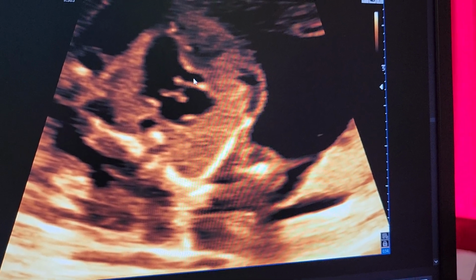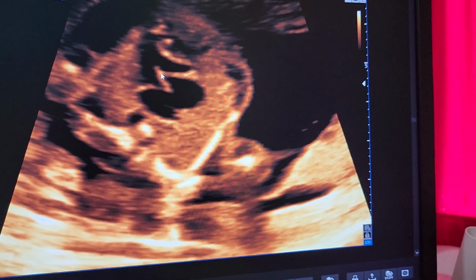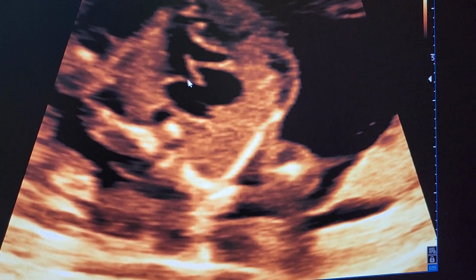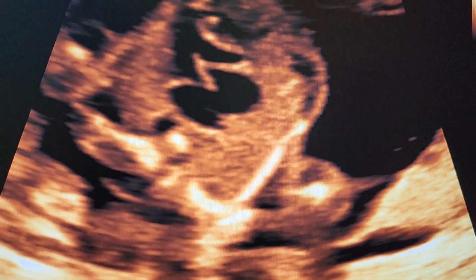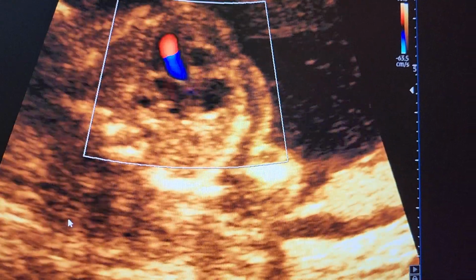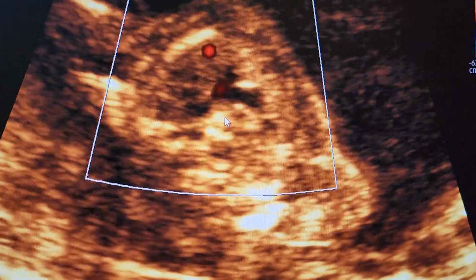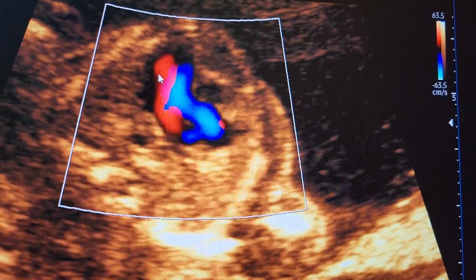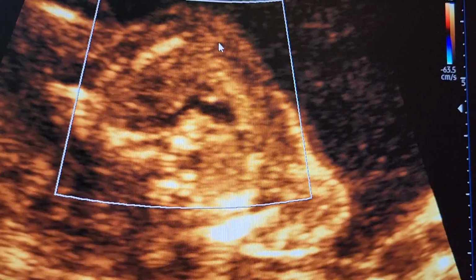That's the left ventricle, that's the right ventricle, and that's the communication. You can see in the crux we have a normal apical insertion of the tricuspid valve, normal basal insertion of the mitral valve. So this is the normal offset which is visible. So the crux is normal. Further, when we do the color Doppler across the four-chamber view, you can see this is the LA, that's the LV, this is the mitral inflow. On the right heart, we did not see a normal inflow.